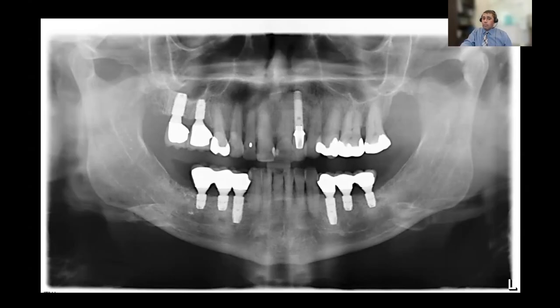Now, one area of concern here, particularly with the maxillary implant, is the position of these implants relative to the crown. You would like those implants normally to be central, so you don't have an offset that goes either to the mesial or the distal. This will act almost like a cantilever of the implant, increasing the stress on the implant, and you may have higher risk of screw loosening, screw fracture, and I've seen even cases in some patients who are bruxers or clenchers that you may have even implant fracture.